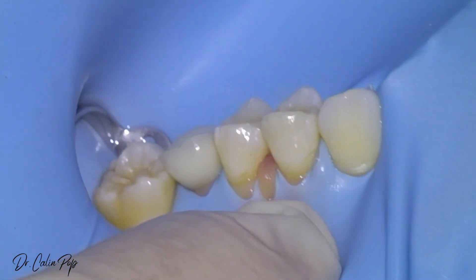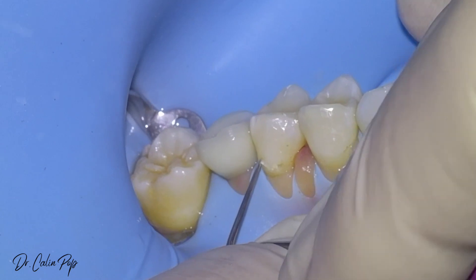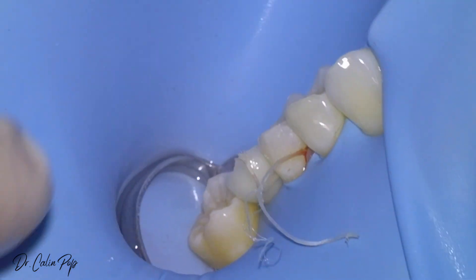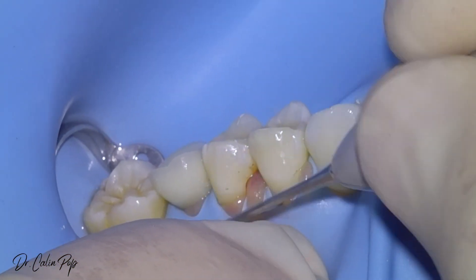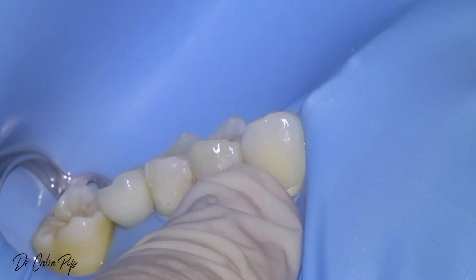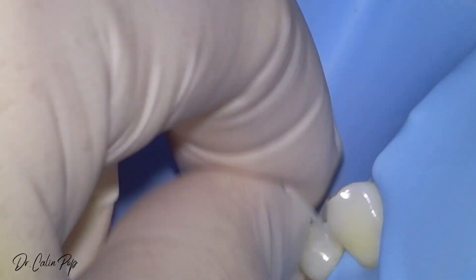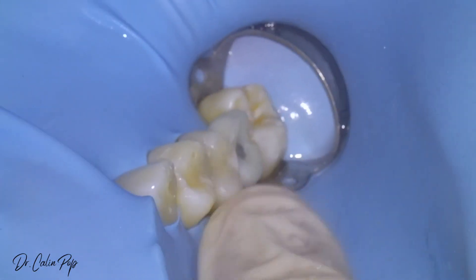Where's the floss? You can see I'm dragging. The soft tissue is still retracted. I have access to the sulcus. If I remove the sheet, it's quite hard — the sulcus is relaxing. Maybe it's bleeding. It's already dark. The lip is covering the area. I make sure I remove — I place it here and here. That's it. Here I didn't place anything, and I just retract from this side.